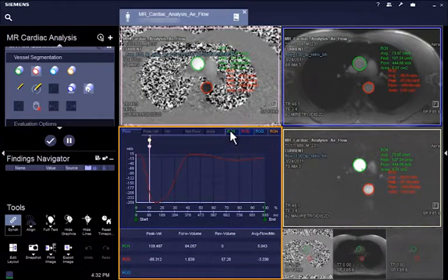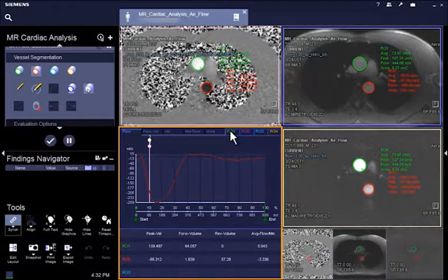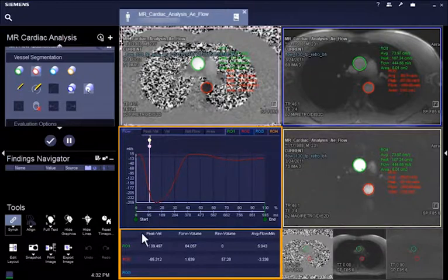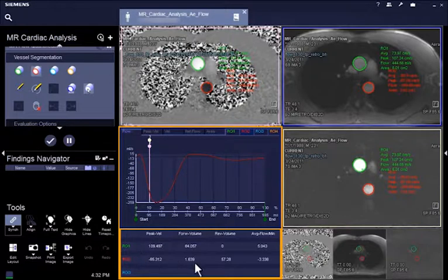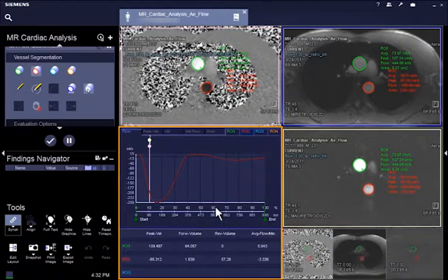You can choose to display or not the curve corresponding to this ROI for comparison purposes. For each ROI, the quantitative result of peak velocity, forward volume, reverse volume, and average flow per minute are displayed below the graph.